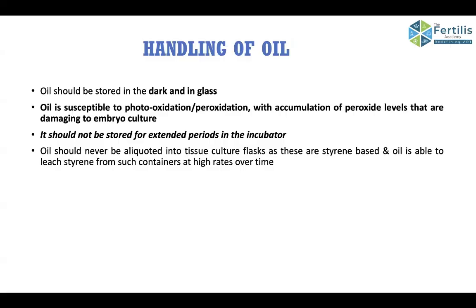When you talk about handling of oil, oil should be handled in dark, and preferably it should be transported in glass bottles and not plastic bottles. It is susceptible to photo-oxidation or peroxidation, which can damage the embryos. And many times, people store oil for long periods in the incubator. It's not a good idea. Don't do that.